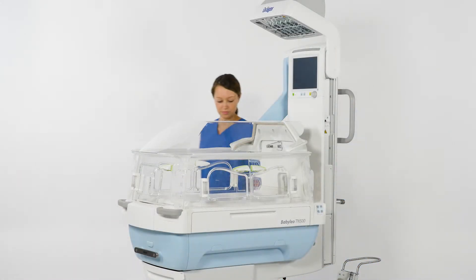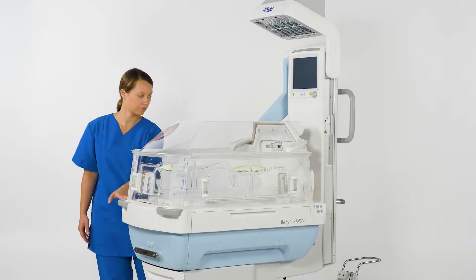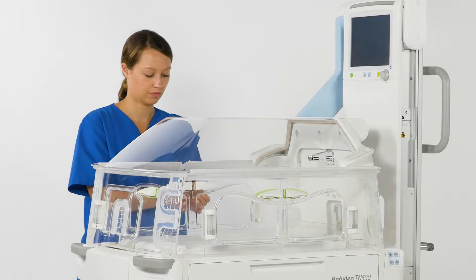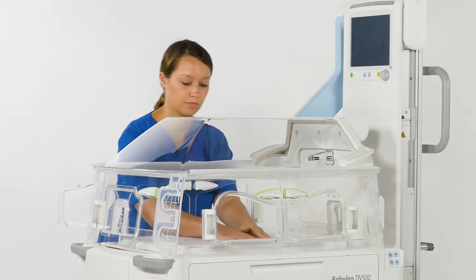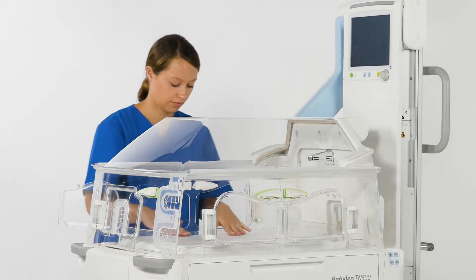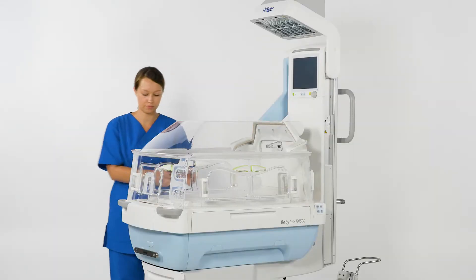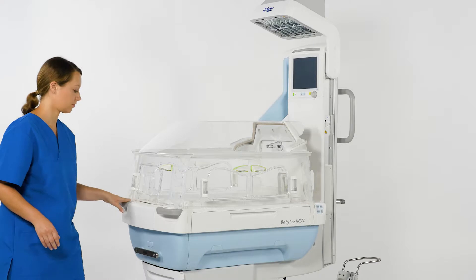Before admitting the next patient, please check the device for operational readiness as described in the IFU and make sure that it is free from defects. Check to ensure that all parts are free from cracks and sharp edges. Also check to make sure hand ports are securely closed.